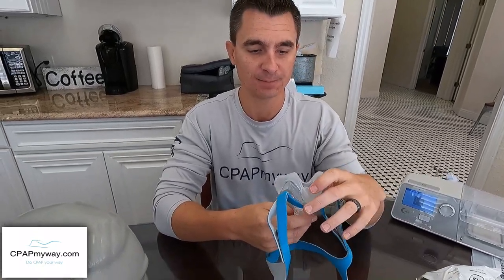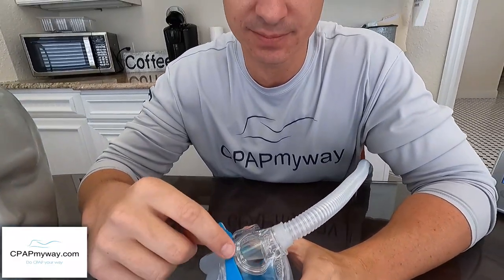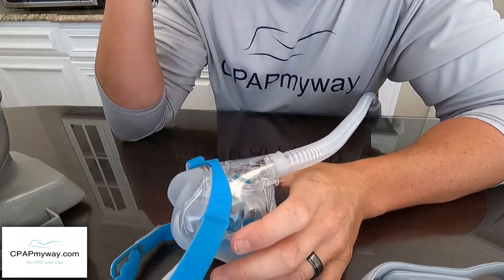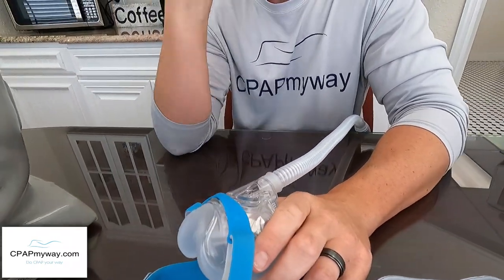Taking it off is just as easy — push down here, push down here, up and over once those are pushed down. The exhalation ports are located right on each side of the tube, and they kind of point down a little bit, which I think will be nice for the bed partner. Because it goes both directions, I think it'll do a good job of dispersing that exhalation really well.